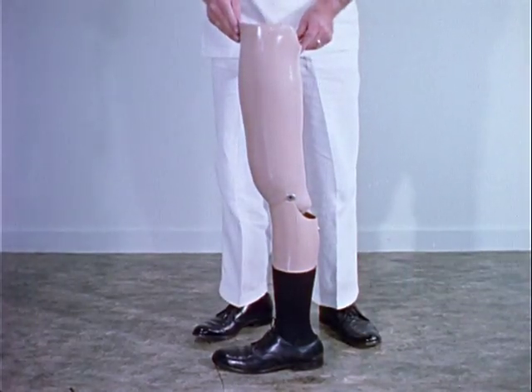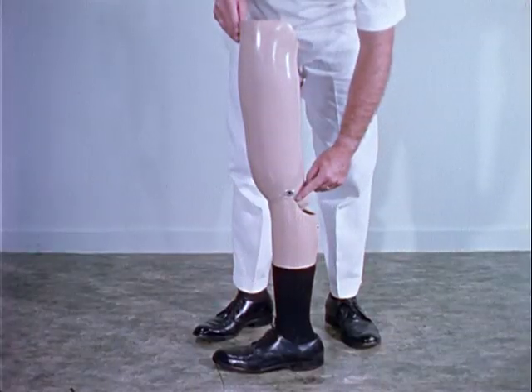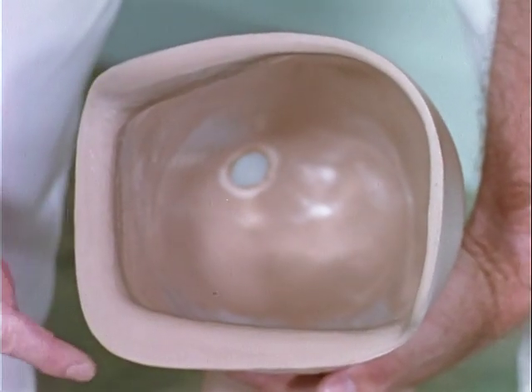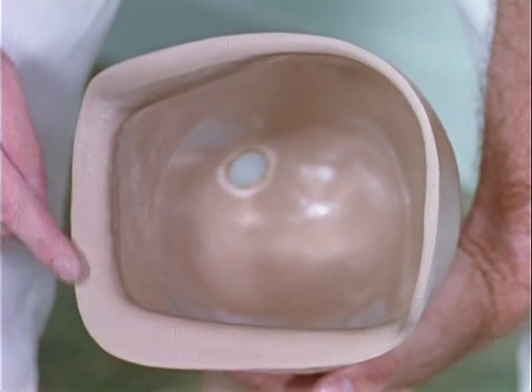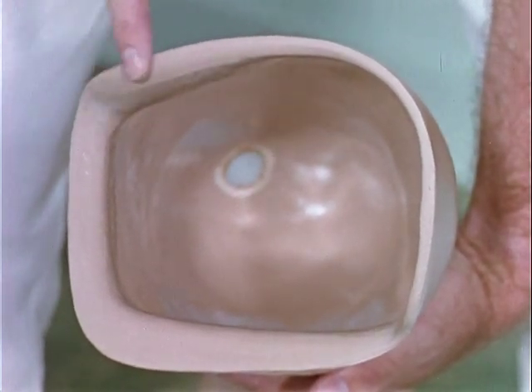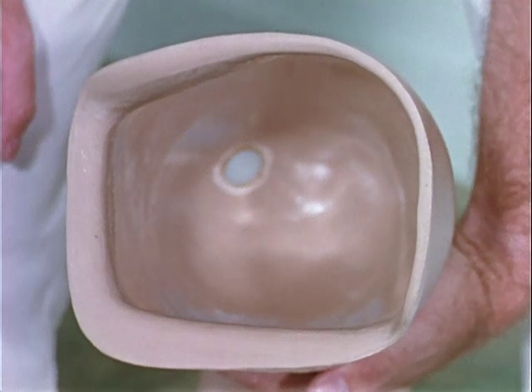This is the quadrilateral total contact suction socket prosthesis. It contains a constant friction knee joint which can readily be adjusted. The ischial seat provides the major weight-bearing area. The anterior medial corner is the channel for the adductor longus and gracilis muscles. The scarpus bulge and the high anterior and lateral walls provide the necessary stability to force the stump back onto the ischial seat.